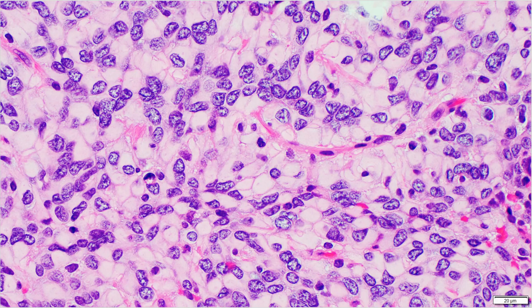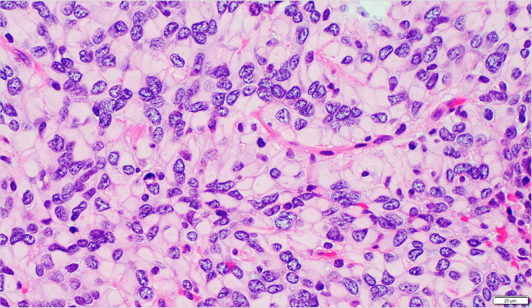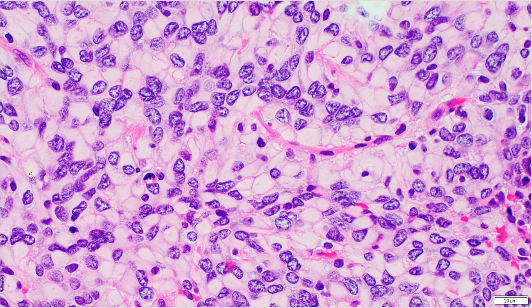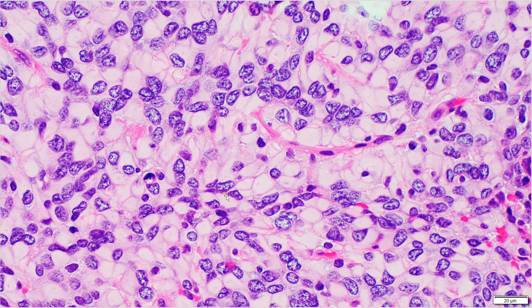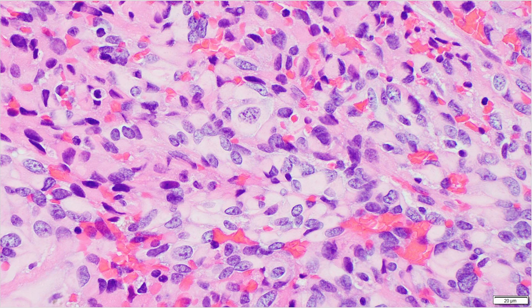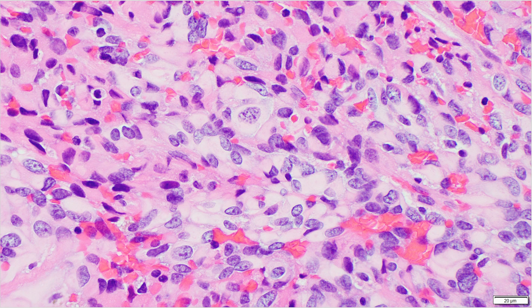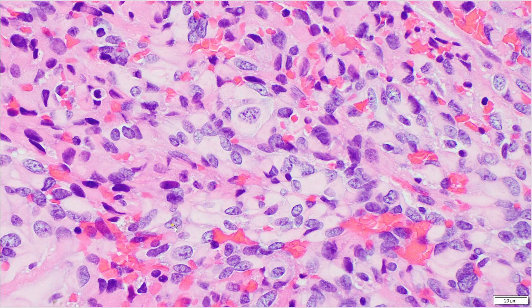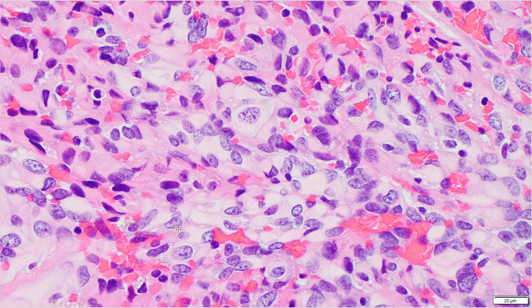Here's another viewpoint. Again, very prominent cell borders and these cytoplasmic inclusions that push the nuclei off to the side. Oftentimes the rhabdoid variant of meningioma will have increased mitotic activity, necrosis, prominent nucleoli, and may have anaplastic features.